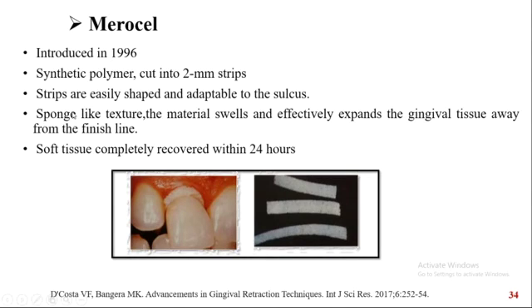This structure tends to absorb the oral fluids from the gingival sulcus and tends to swell up, which expands the gingival tissue away from the finish line. Also, adequate fluid control is achieved. However, they do not contain any hemostatic agent, so it does not achieve adequate hemostasis.